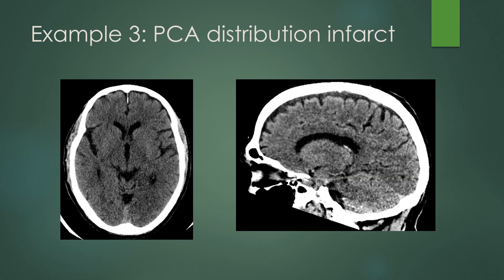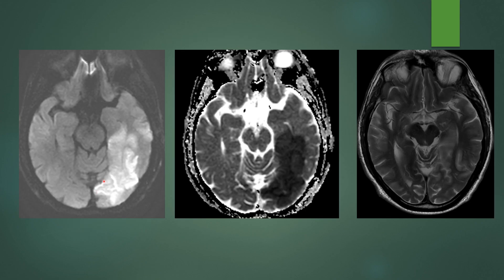Example three is a PCA distribution infarct. On CT, you see subtle low attenuation involving the left occipital lobe extending to the mesial left temporal lobe. On the sagittal view, subtle low attenuation involving the cortex of the left occipital lobe compared to the normal bright cortex superior to the infarct. On MRI, there is restricted diffusion involving the left occipital lobe extending to the left mesial temporal lobe, with low ADC signal and hyperintense T2 signal — actually brighter in the mesial temporal lobe than in the occipital component.